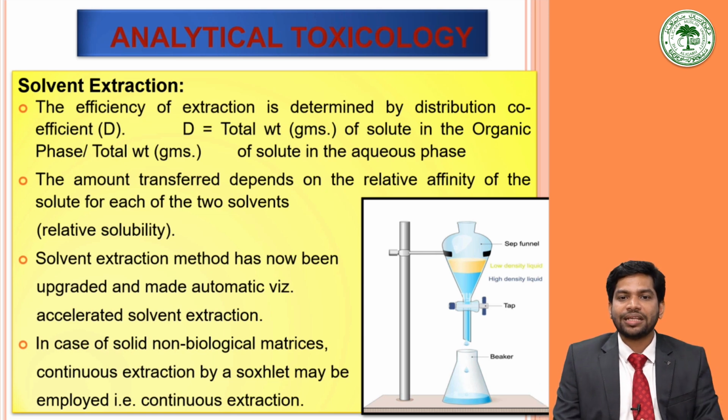Solvent extraction is a common technique in forensic toxicology related to biological matrices. The solvent extraction method has now been upgraded and made automatic with accelerated solvent extraction. In case of solid non-biological matrices, continuous extraction by the Soxhlet may be employed, that is continuous extraction.